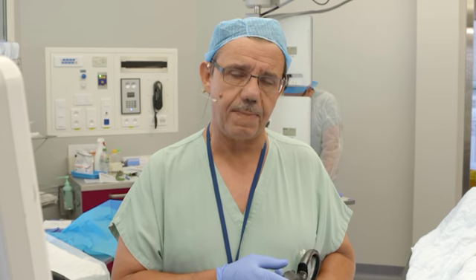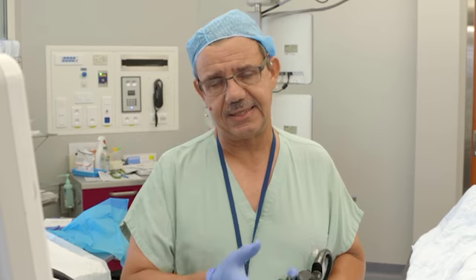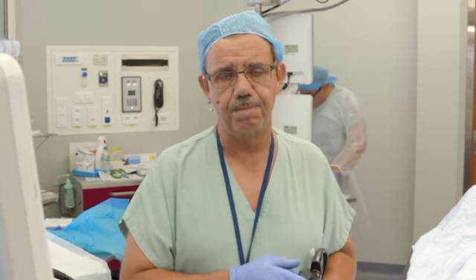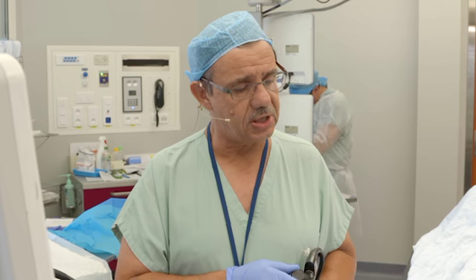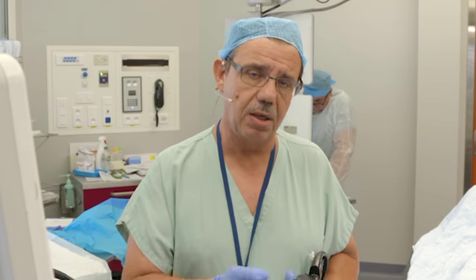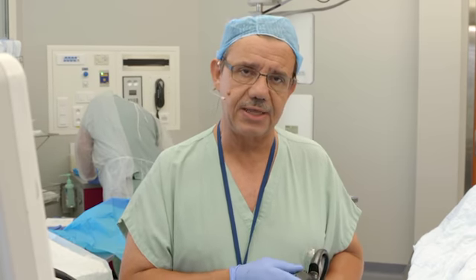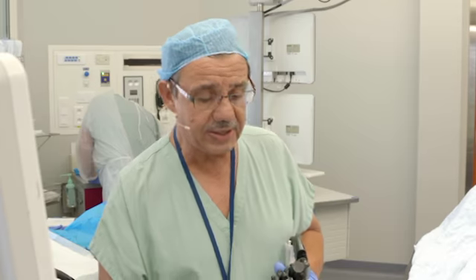And the goal today is to perform a combined procedure. The first procedure is the EUS to assess the precise staging of this lesion, in particular for the bile duct and the pancreatic duct, to know if an endoscopic resection is possible or not. And the second procedure will be either an ampulectomy if the lesion is endoscopically resectable, or, more probably, to exchange this plastic stent for another stent because the patient always has a high level of bilirubin. Okay, I will start the examination.